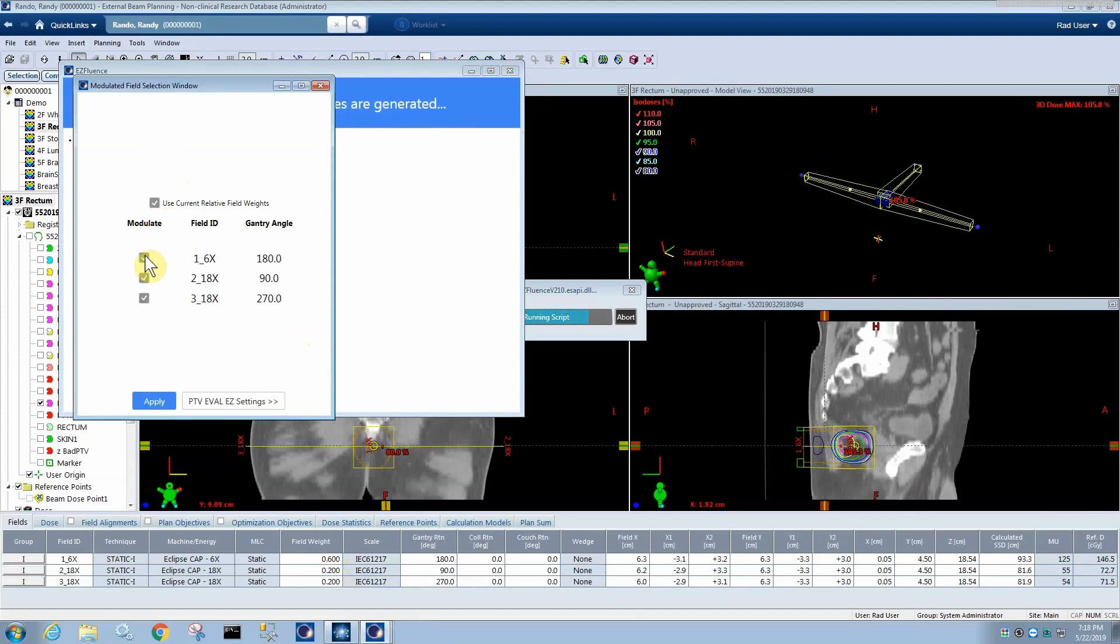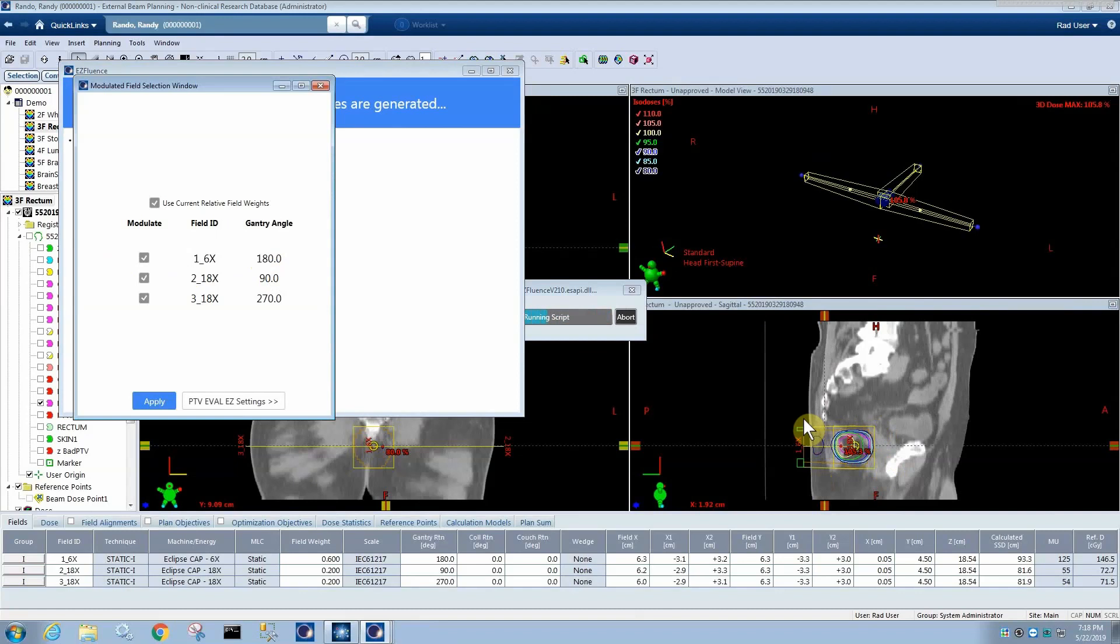I like those for a three-field rectum, so I'm going to say that's what I want. You can also choose which fields you want to modulate. I highly recommend only modulating fields where you probably would have put a wedge or done a field-in-field on them. The reason is that, for example, this beam coming in from the posterior side, there isn't a whole lot of modulation necessary from it, and so it only increases the complexity of the plan and the treatment if you add subfields to it. So you can uncheck that and apply.